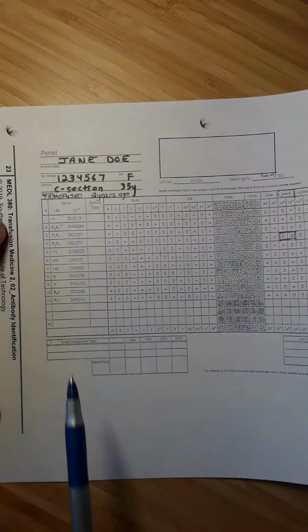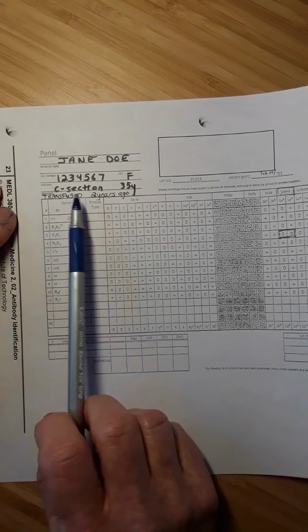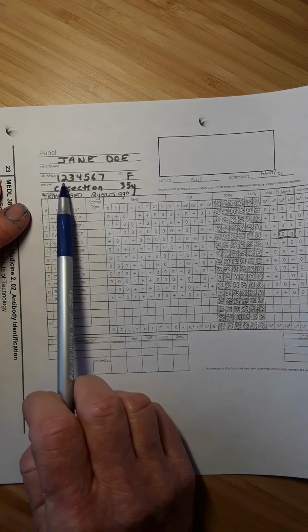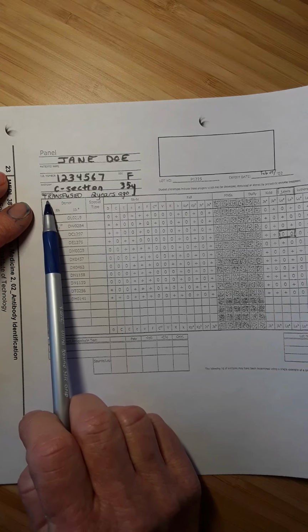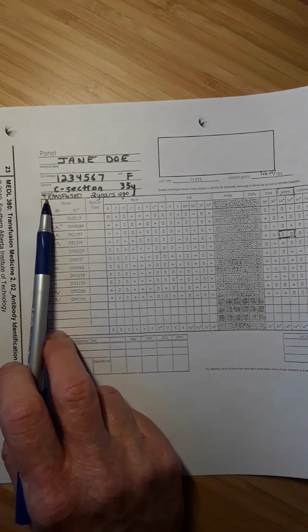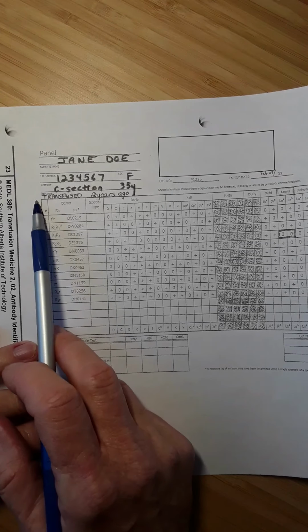I look up here to the patient's information. Sure enough, it is a female. Sure enough, she is in for a C-section. So obviously she's pregnant. And a bit of information that she was transfused 2 years ago. This is important information for me because this lady is pregnant. So there's a baby in there. And if she was transfused 2 years ago, it is possible that she has produced an antibody, and possibly that antibody's titer has increased during the pregnancy, and the baby could be affected. So we definitely need to find out what the heck these antibodies are.